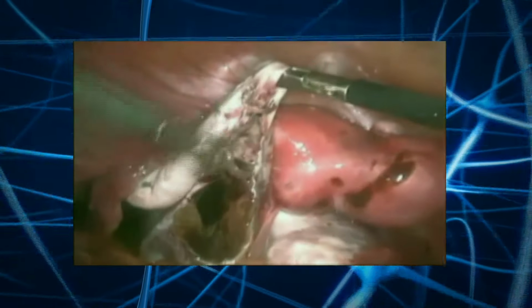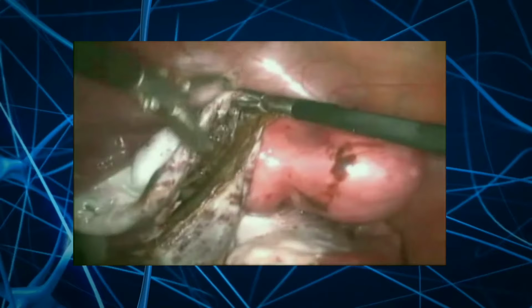It is aspirated. Later it will be washed again, copious lavage. And then this is the inner cystic layer, which you will separate from the outer cortex, same as usual. So, can I go ahead? Because this you already know, that it will be taken.